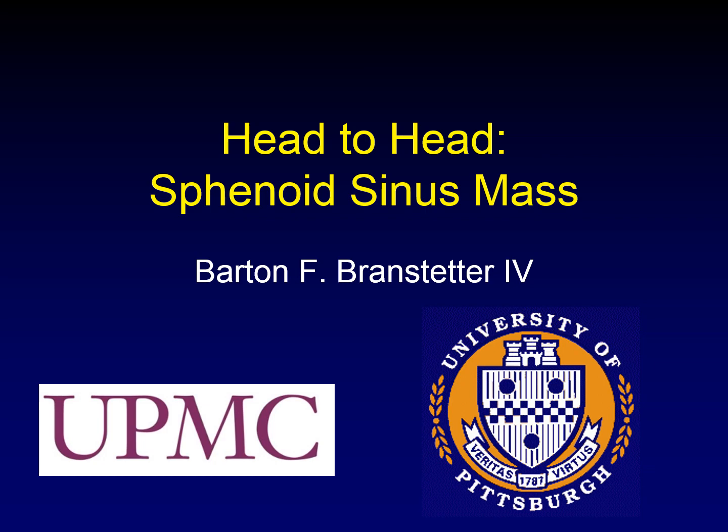Mucus retention cysts, mucoceles, and meningoceles can be very confusing to distinguish. It's important to understand those terms, understand the differences in pathology, and know the clues that you can use to distinguish them on imaging.